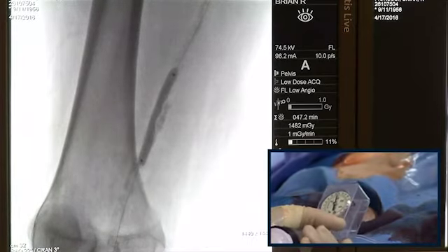So I would combine focal stenting and DCB here. Maybe they could try with the shoulder. So Mehdi, what kind of pressure?